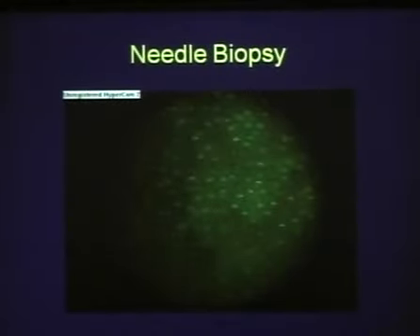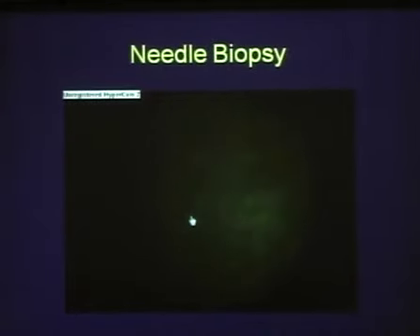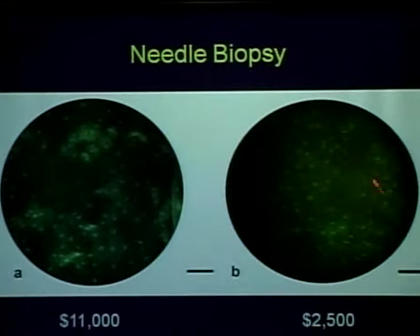We've used this in normal volunteers. This actually is me that you're going to see a video of from the oral cavity with topical acriflavine. And here we're just moving the fiber probe across the oral mucosa, and you can appreciate the nuclei that show up in the image.